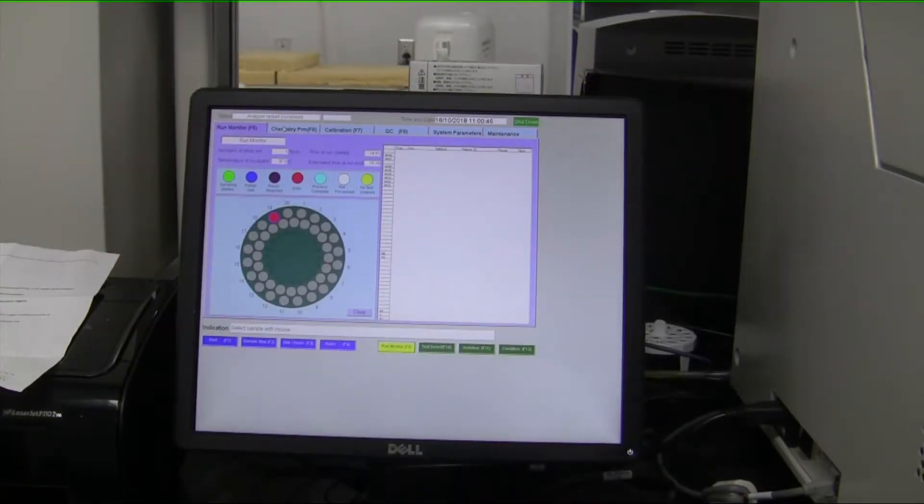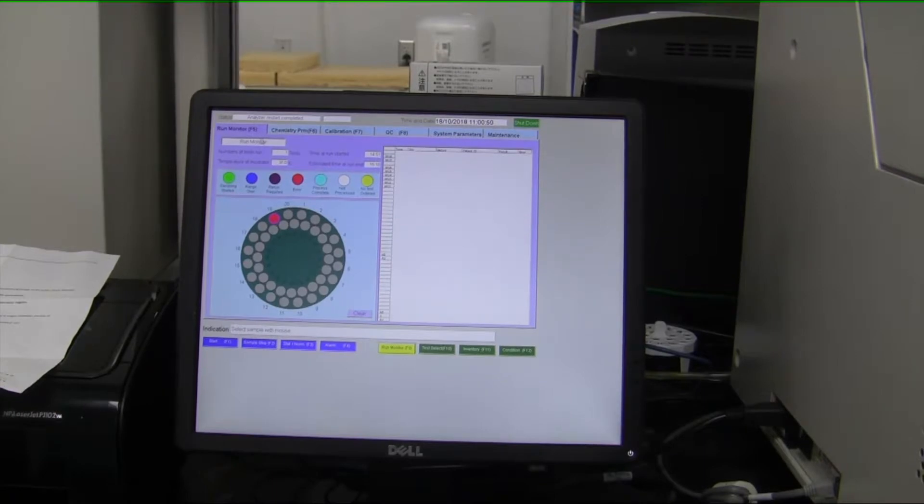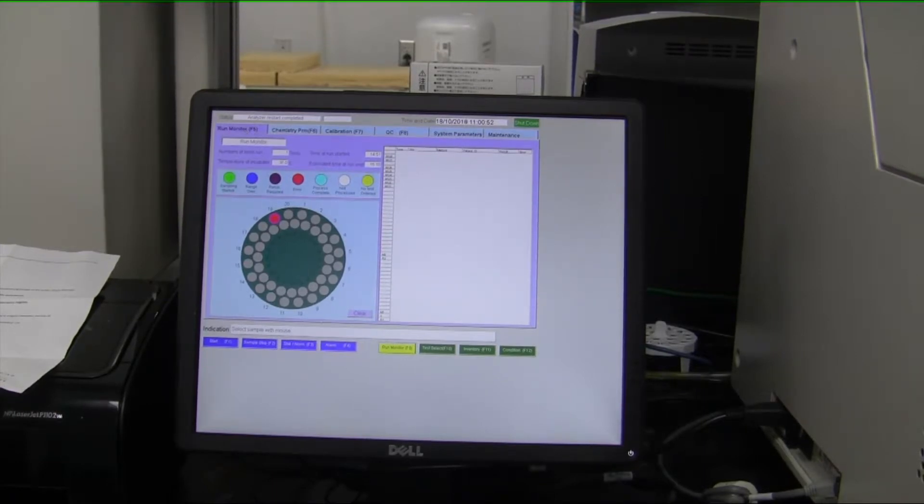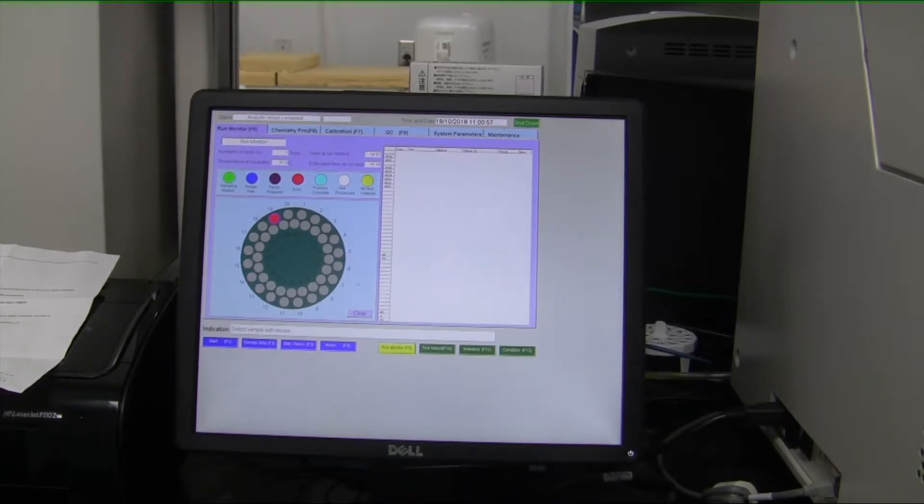We can now tell you a little bit about the user interface for the Randox system. This screen here is called the Run Monitor screen. It just gives you a basic overview about where the sample status stands.